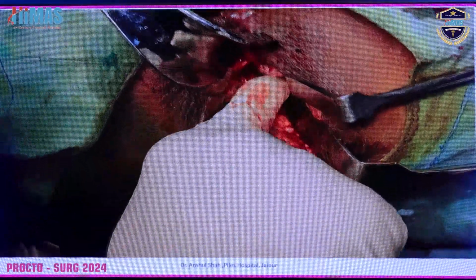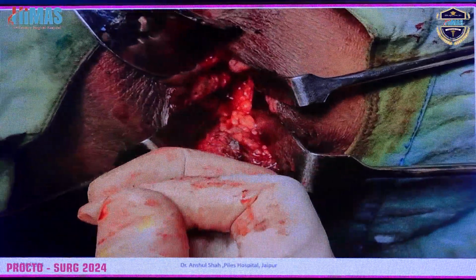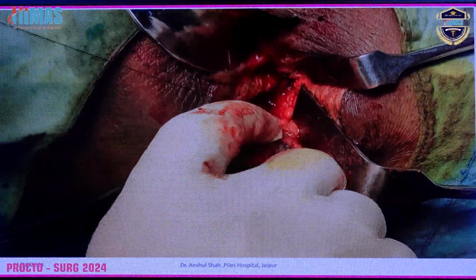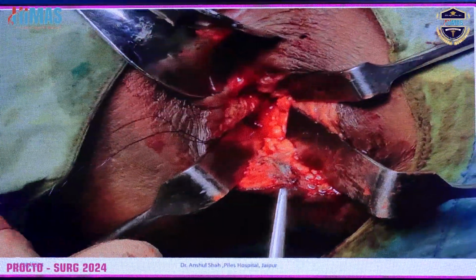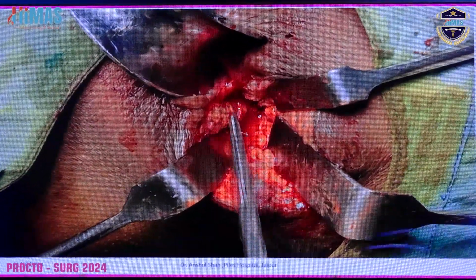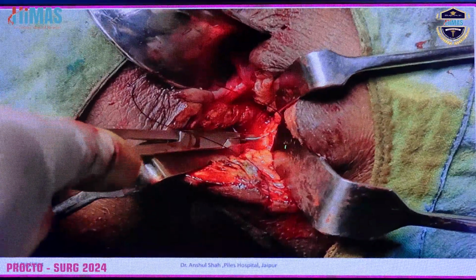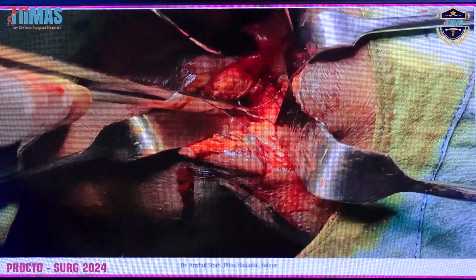They are simple sutures; we are taking PDS 2-0 sutures to repair it. In case the muscle bulk is more, we can use PDS number 1 also. So these are simple sutures we are taking up. After taking these simple sutures, the sutures should never be under tension first of all, because if they are under tension, they will break apart. So there should be very little tension in them, and we'll be leaving this space, this hole which is going inside, open.